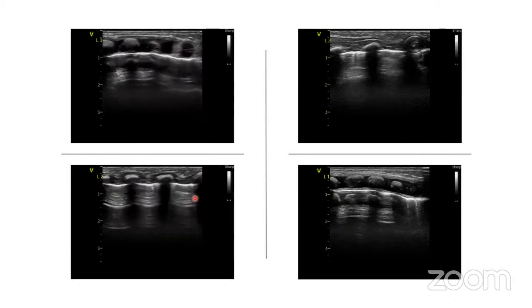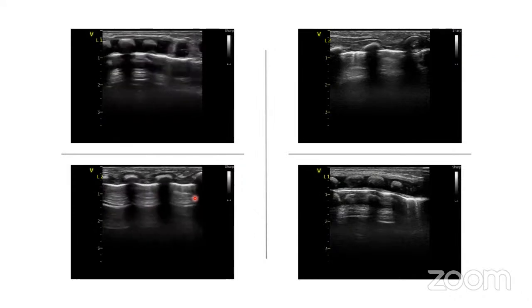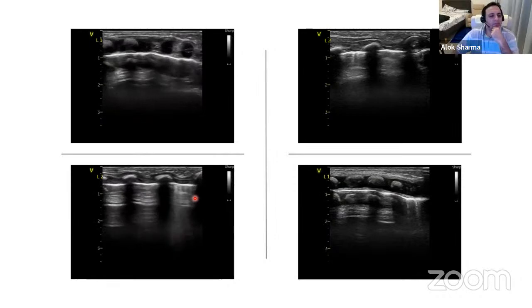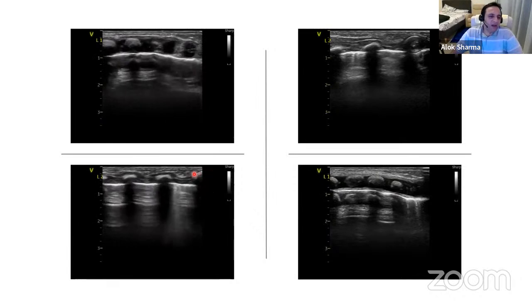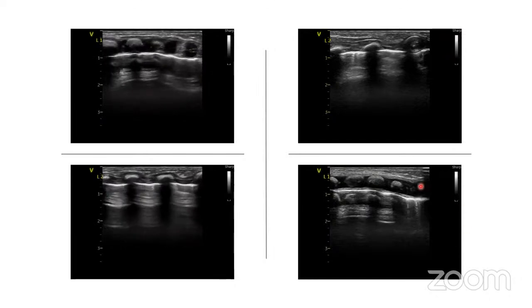Okay. So L2, again, the sliding is normal. You see more B lines on the right side of the image. Mostly A profile, and again it is a normal ultrasound image. Yes, I would agree. Maybe a few B lines that are coming in on that right side over here. The reason they're not so obvious is because I'm using a high frequency, and you probably need a lower frequency to actually see more depth. So, lower frequency. Yeah.